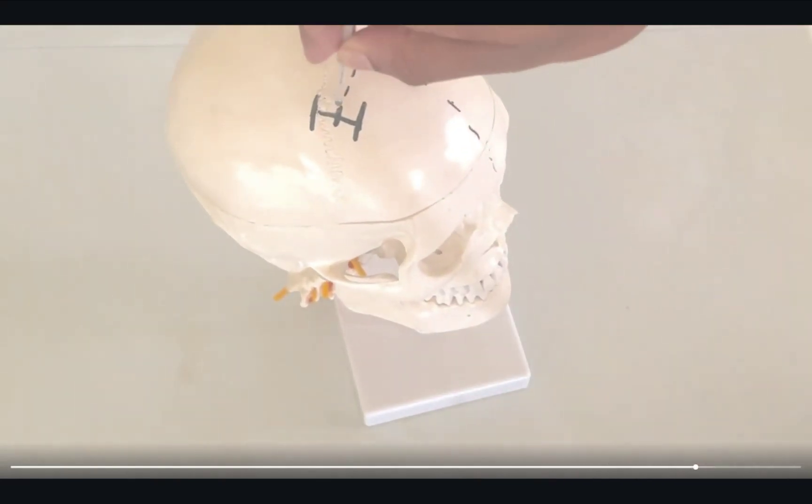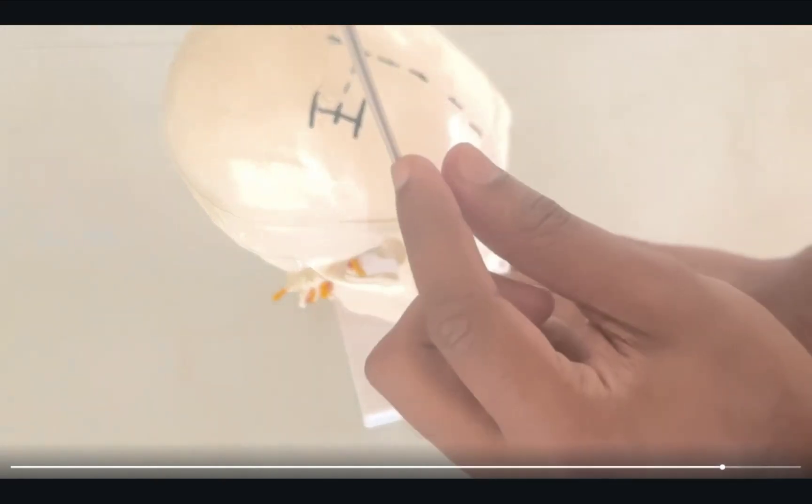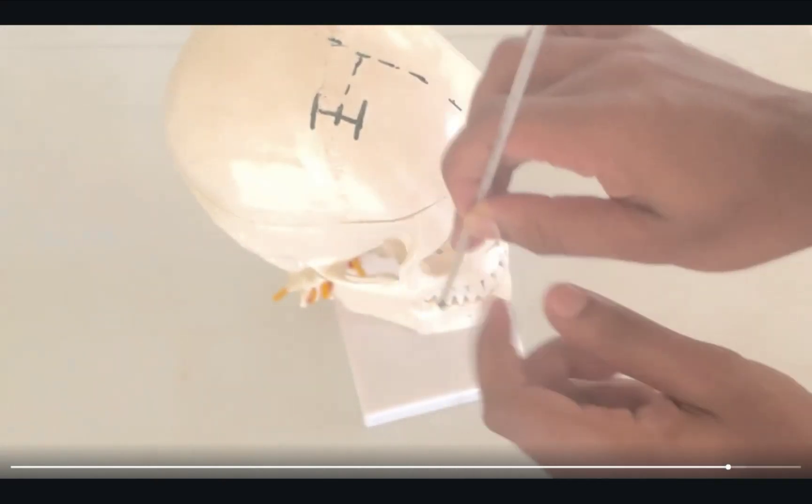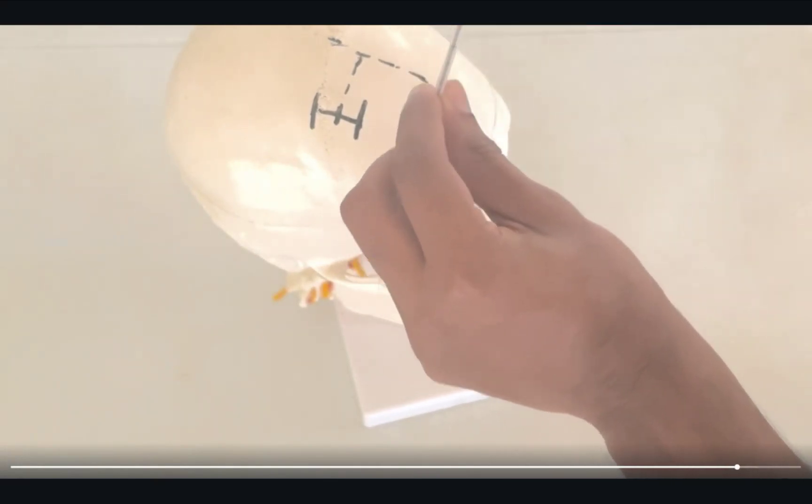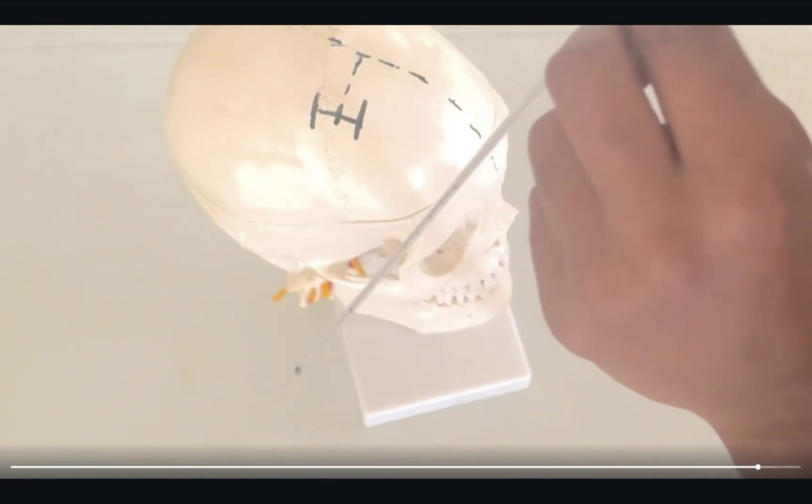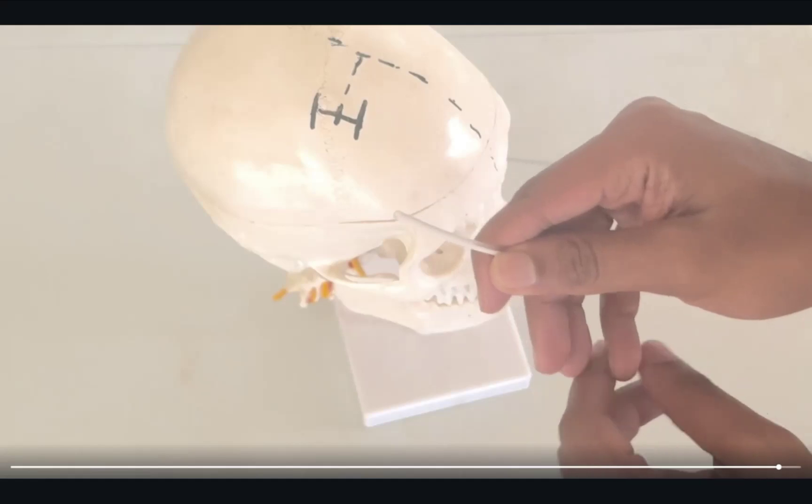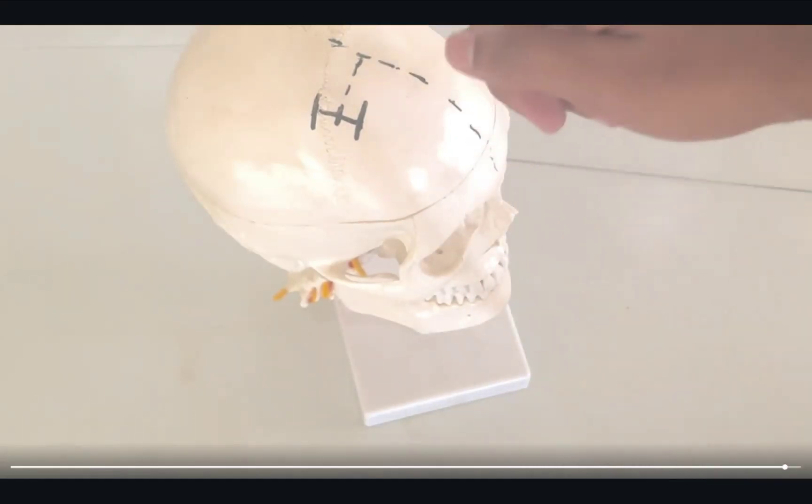You would make sure that your EVD goes exactly perpendicular to the brain. Once you hit CSF and you can see the CSF flowing up the chamber, you can introduce the EVD one centimeter without the stylet. Then you can remove the stylet and the tube stays behind. You would then connect the end to a cap, tunnel it at the skin, and close the incision.